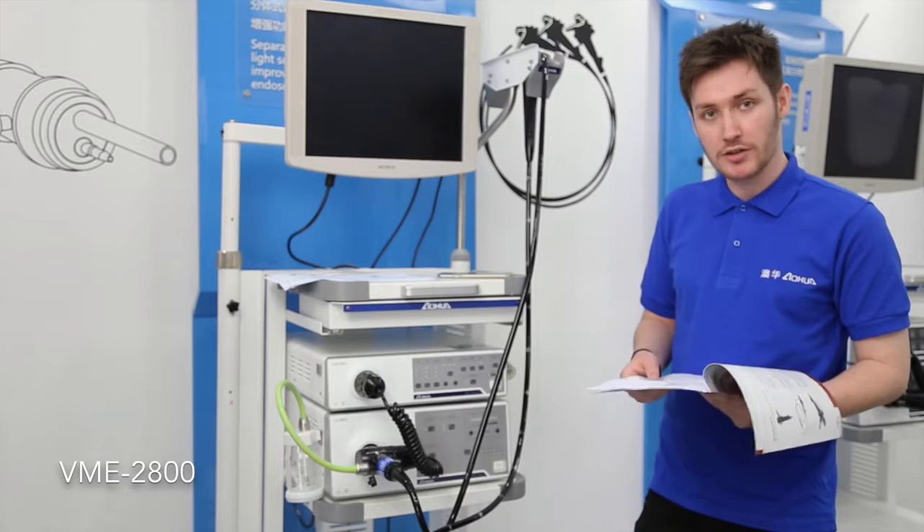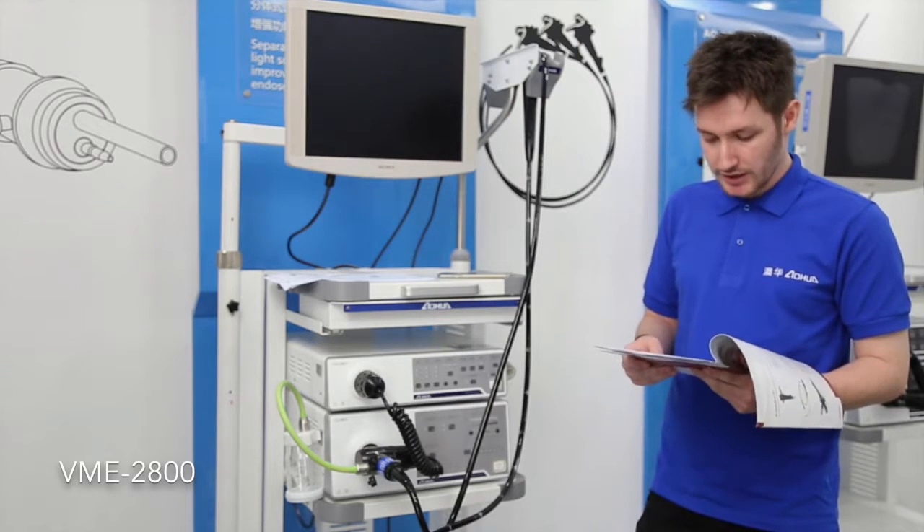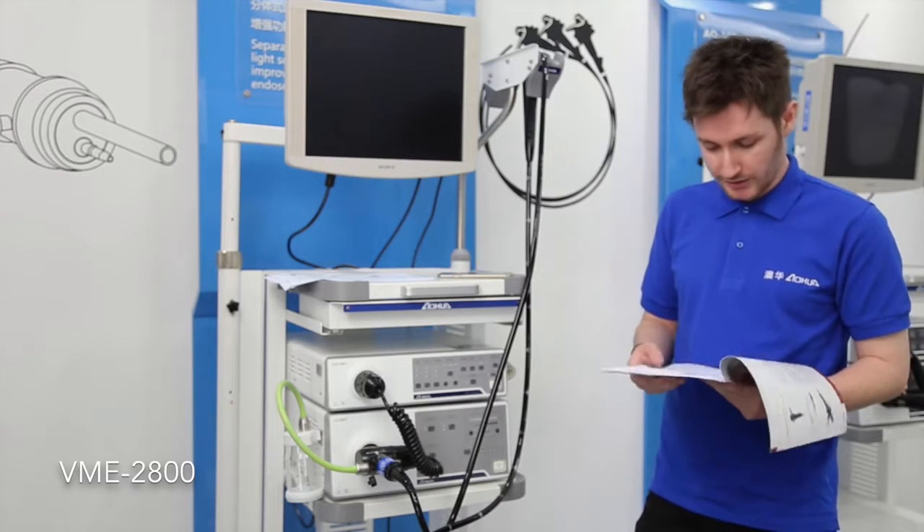It's compatible with all types of scopes — GI, ENT, urology, and gynecology. So if you want to establish a multifunction endoscopy room, it's a great choice.